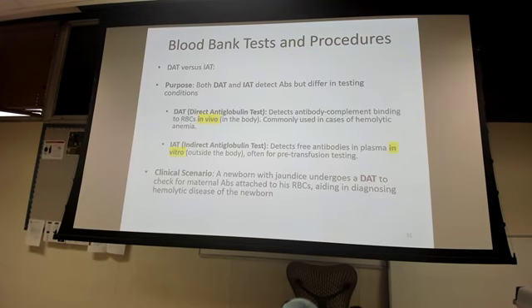Okay, so this says DAT versus IAT. That was already on a previous slide. So DAT, just think in the body, we're testing things that are going on within the body, versus that IAT, we're testing outside the body. This is all done prior to transfusing.